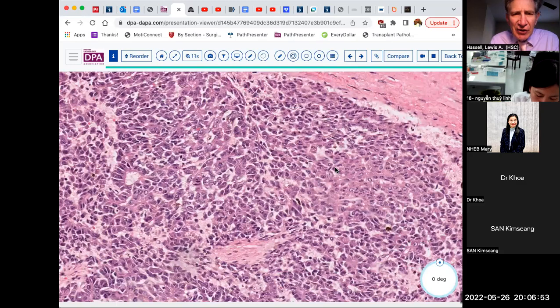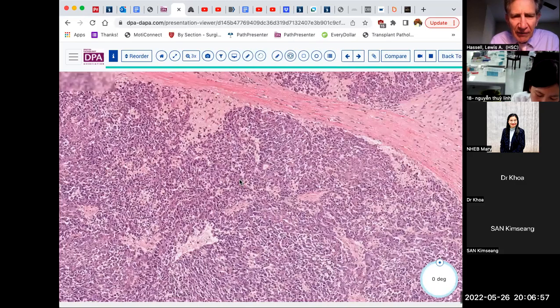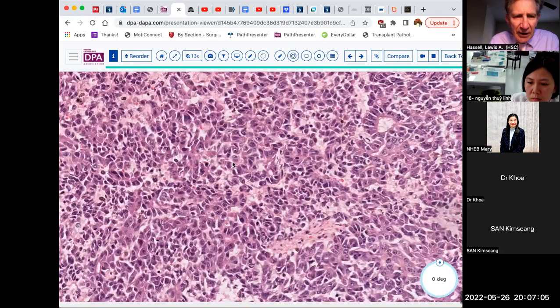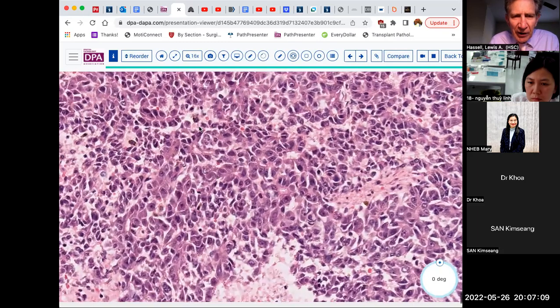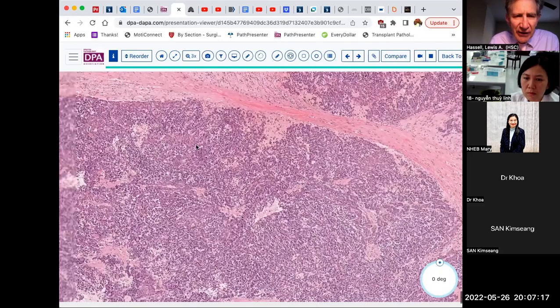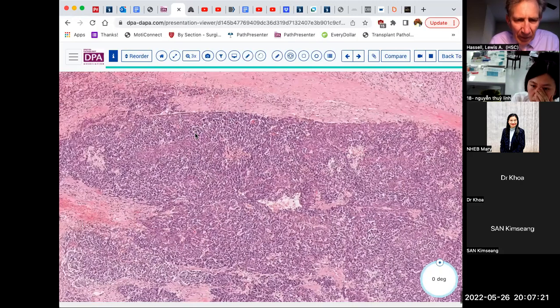The hepatoblastoma is trying to recapitulate the stages of growth. And so sometimes you'll see a small tubular formation like you do here. And other times it will be just more solid sheets with a little bit of trabecularization and maybe some admixed stroma to indicate that there's development of a lobule type of structure.